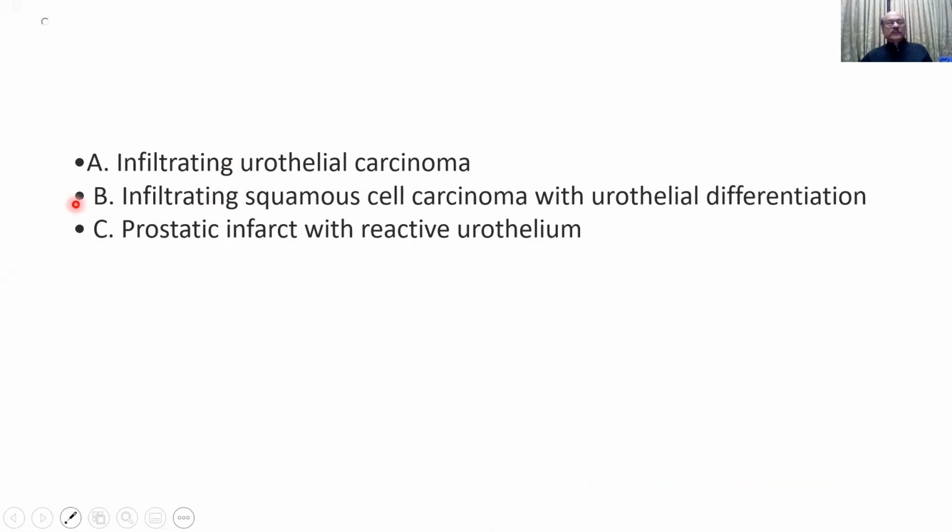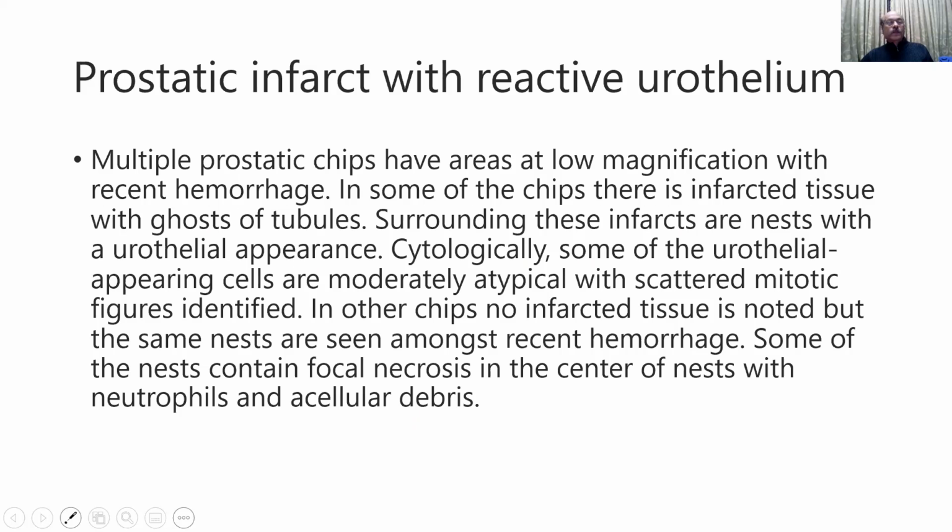Now we have to decide whether it is infiltrating urothelial carcinoma, infiltrating squamous cell carcinoma with urothelial differentiation, or prostatic infarct with reactive urothelium. So now let's see, this is actually prostatic infarct with reactive urothelium. Multiple prostatic chips have areas at low magnification with recent hemorrhage.